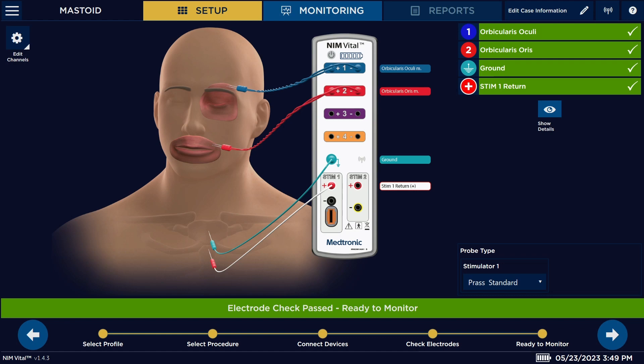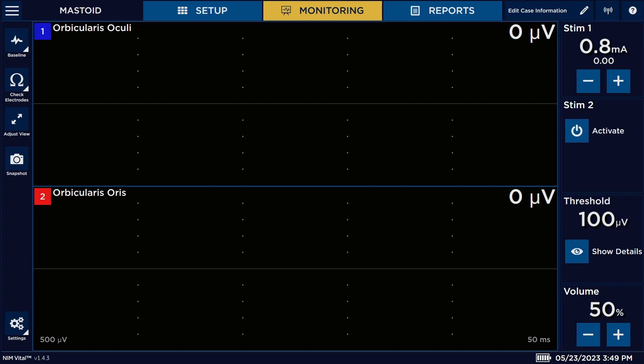Once you have all of those connected, like you see here on the interface, everything is going to go green to let you know that you can proceed. You would then proceed to your next step by hitting your arrow, and now you're in your main monitoring screen.